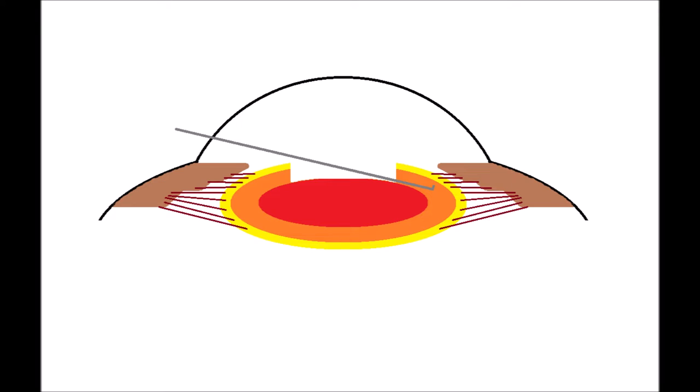it goes under the epinuclear ridge and slides out into the capsular fornix. You rotate the chopper tip down, and the chopper is now in good position between the epinucleus and the endonucleus, and you'll be able to do the double chop and cross chop.